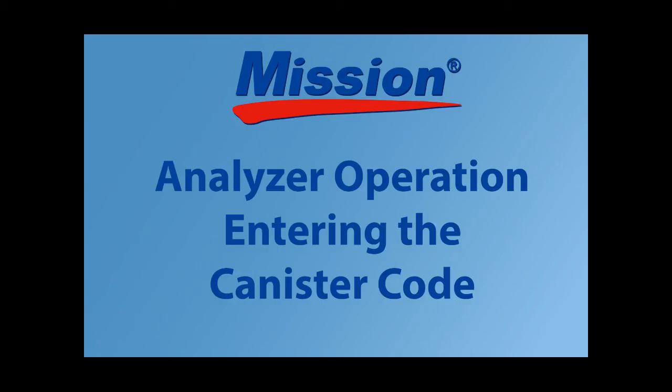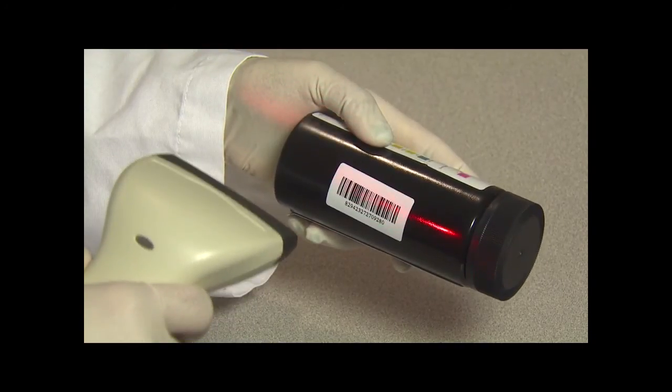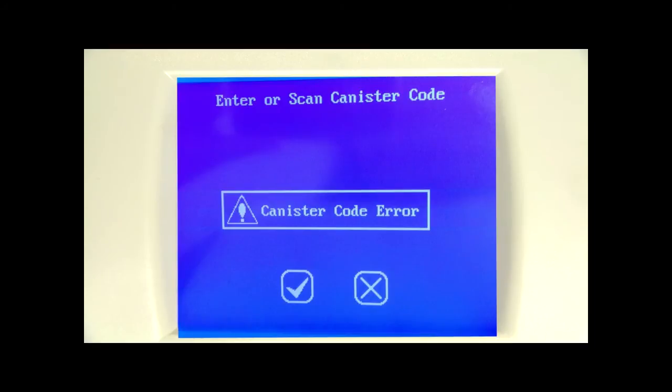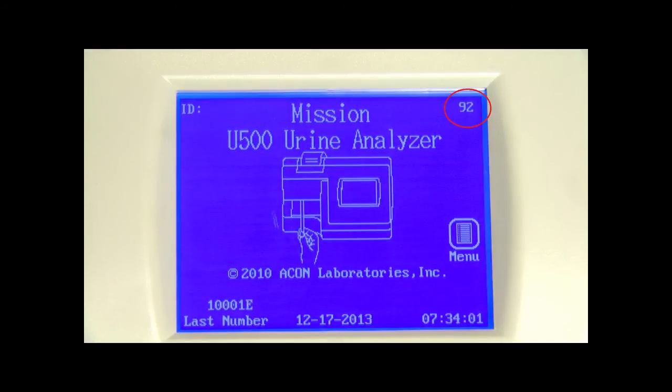When a new canister of strips is required, the analyzer will request that a canister code be entered from the new canister. The code can be entered manually from the keypad or scanned with the barcode reader if installed. If the canister code is incorrect, an error screen will show — check that the strip brand and type of strip match the analyzer setup, and verify that the date and strip expiration are correct. After 3 seconds it will return to the previous screen. If the canister code is correct, the analyzer will proceed to the initial screen. You can also press the digit on the top right corner of the initial screen to input the canister code when the digit shown is less than 500.